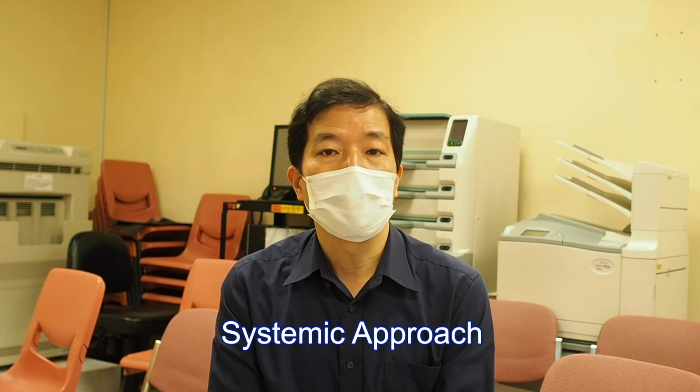Systematic approach. Lastly, I'm going to share with you a principle which is very important in radiographic positioning. This is what I call a systematic approach. In simple words, it means that a radiographer should conduct the positioning in a systematic manner, doing things step by step. A common pitfall for a radiographer is to go straight to centering, but in fact, there are 3 steps before centering. Please note that we have excluded request form reading, patient identification, and patient preparation in this systematic approach.